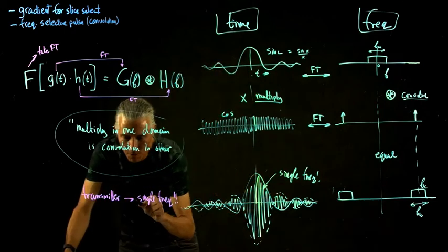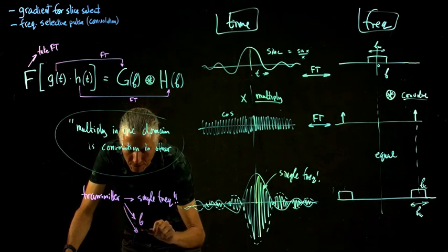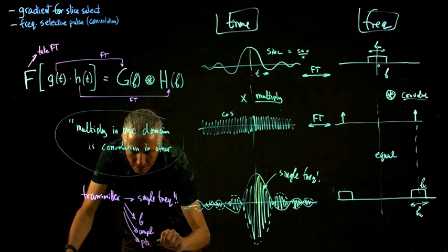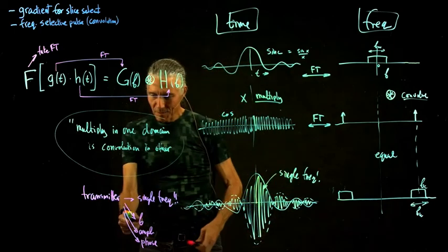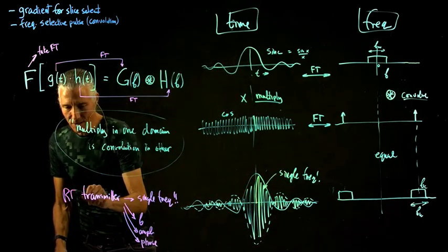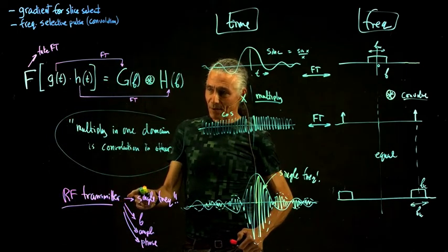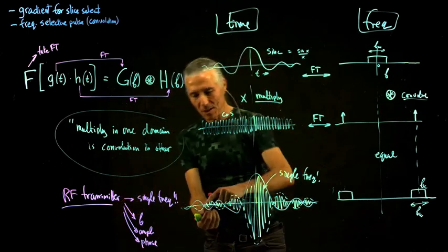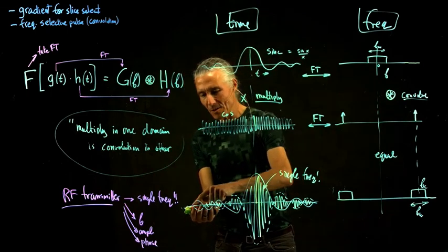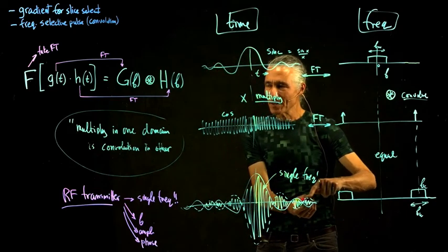And what can you control? Well, you can control what the frequency is, and you can control the amplitude, and you can control the phase. Exactly where the zero is. So that's actually what the RF transmitter in the magnet does. It just generates one frequency, very good copy, quality one frequency. But then what does it do to make an RF pulse? It just generates that one frequency and then just goes like, woo, woo, woo. It just changes the amplitude of that one frequency.